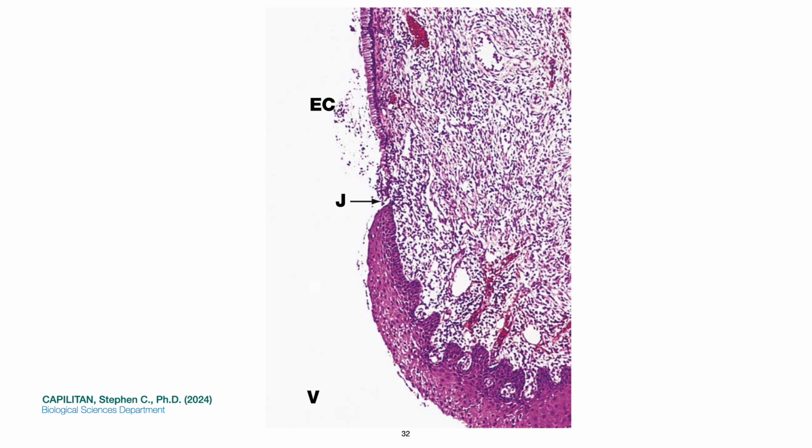This is the uterine cervix in H and E and low power. The uterine cervix, as you know, is protruding into the upper vagina and contains the endocervical canal linking the uterine cavity with the vagina. The function of the cervix is to admit the spermatozoa into the genital tract at the time when fertilization is possible, for example, around the time of ovulation.